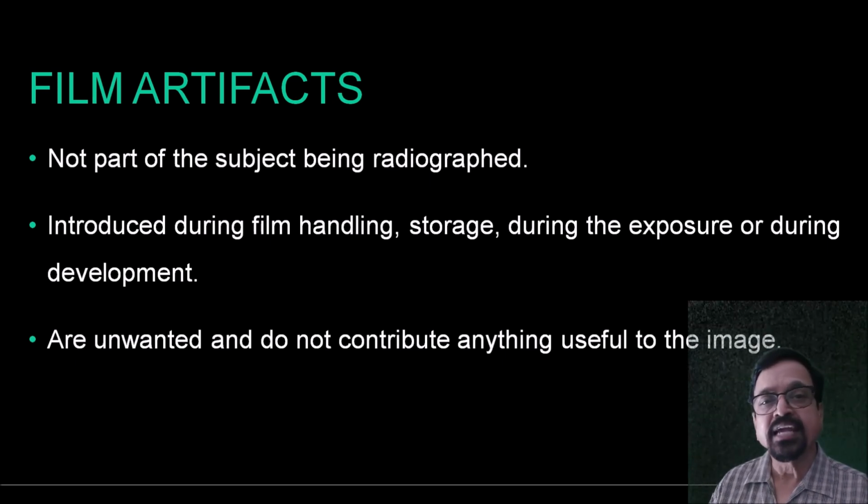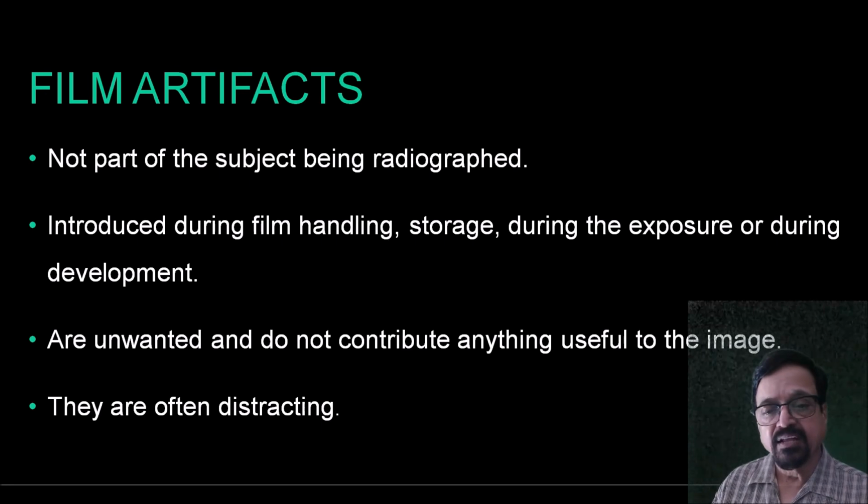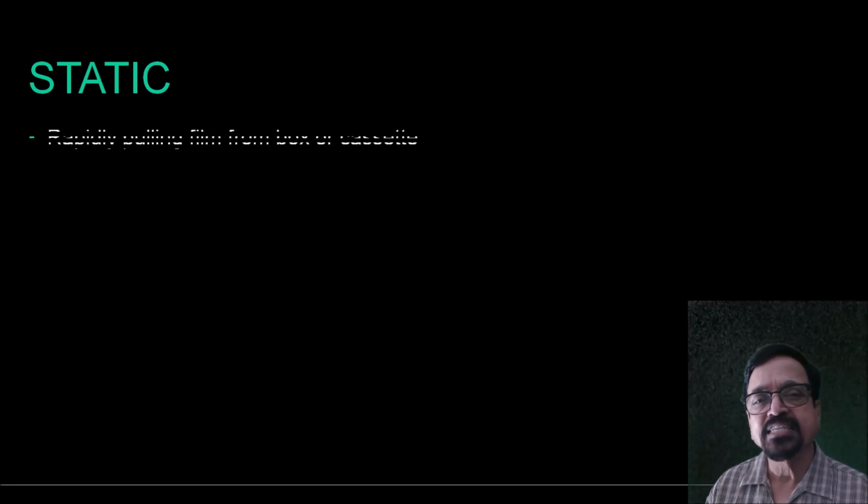Sometimes the artifact looks like a pathology, and here the real skill comes. And they are distracting, they are of no use. There are certain artifacts which we are going to discuss. There are n number of artifacts, but let us see some here.